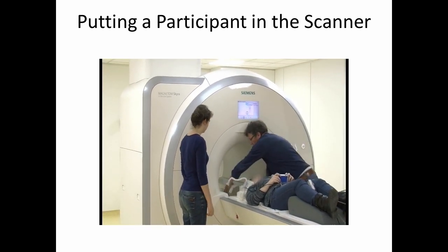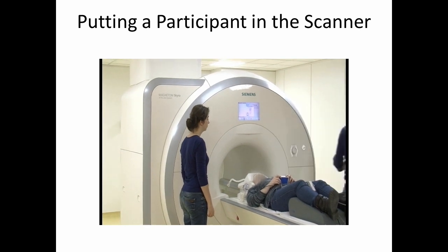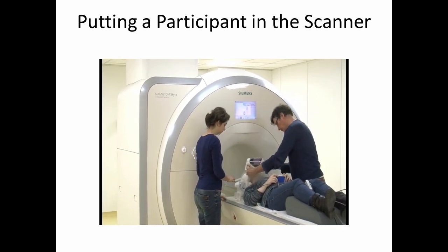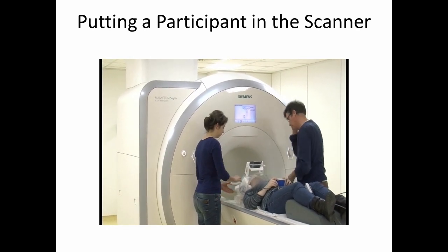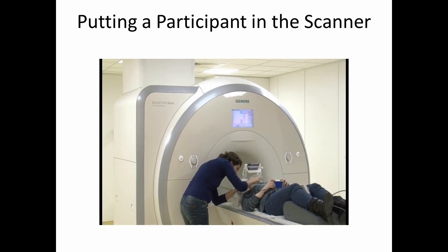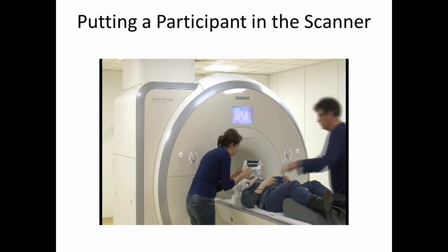Here, we put some padding around the participant's head. This does two things: first, it makes sure that some of the extra noise is cancelled out, and also that their head stays nice and still once they're inside of the radio frequency coil. Now, we're going to be putting on the mirror, which will take the display from the projector and angle it down towards the participant's head, so that they can actually see the stimuli we're presenting to them. In this study, we're actually going to be recording what the participant says, so we have a magnetically shielded microphone that allows us to do that.